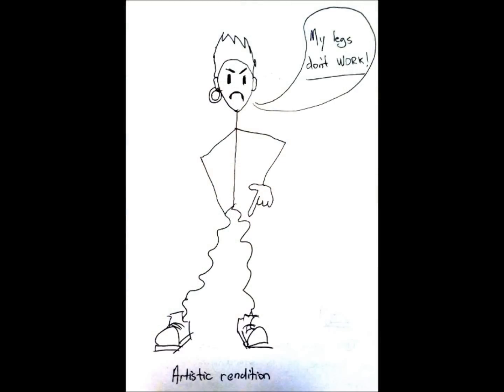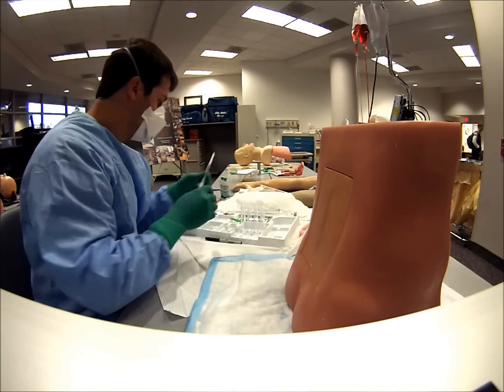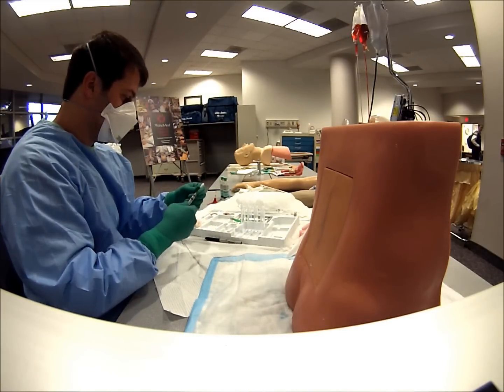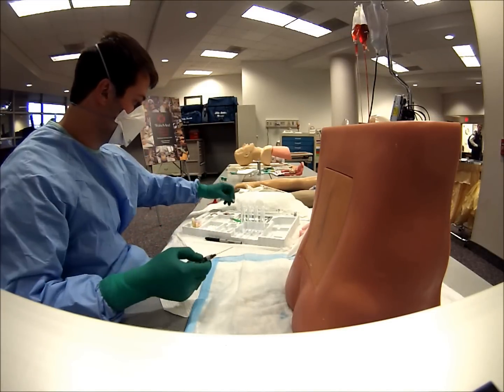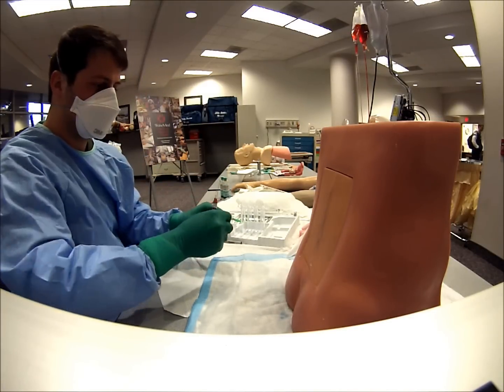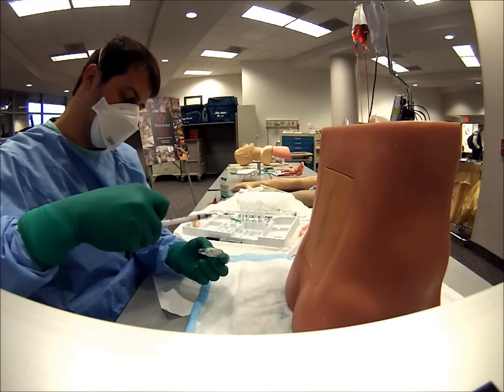It is particularly important not to go above the L3 spinous process, as this could cause spinal damage and paralysis in the lower extremities. This is especially imperative when referring to pediatric patients, because their cord extends all the way to L3.